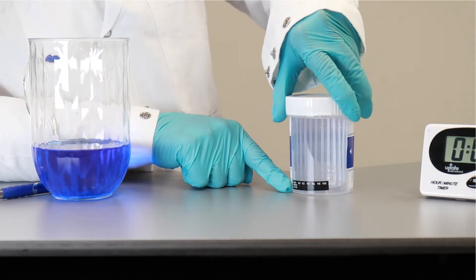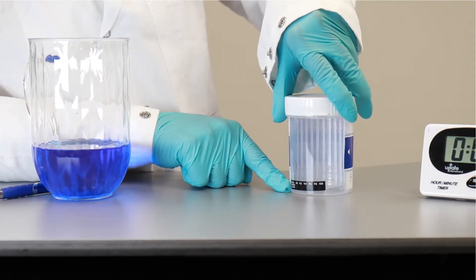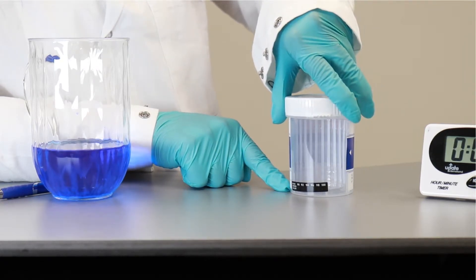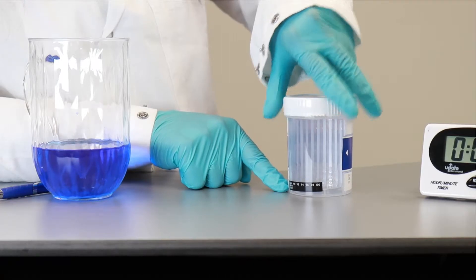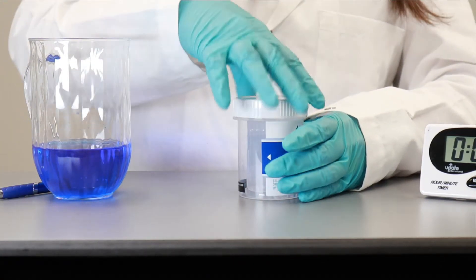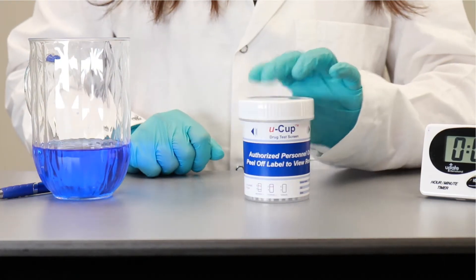Also, in the back of the cup, there is an LCD temperature strip to make sure that the urine temperature is within the range of biological urine. So you can tell if the urine is biological or it is synthetic, which is very common these days.